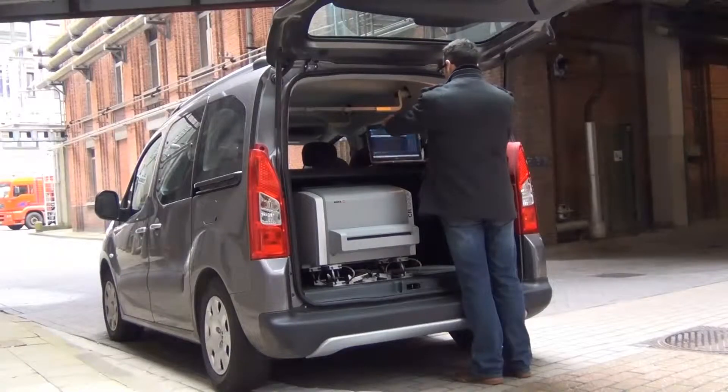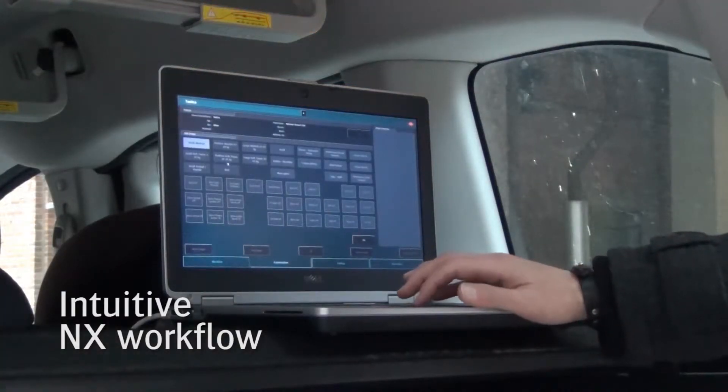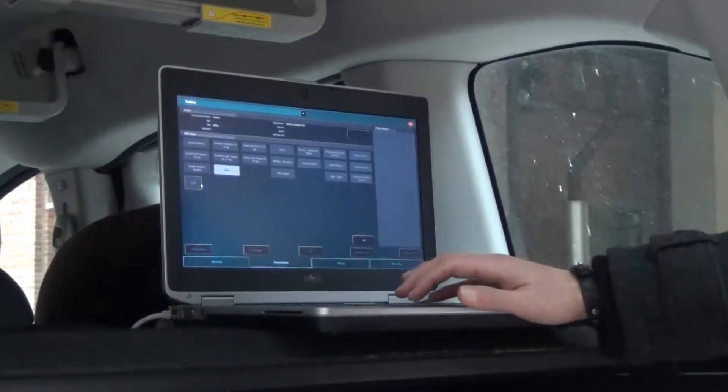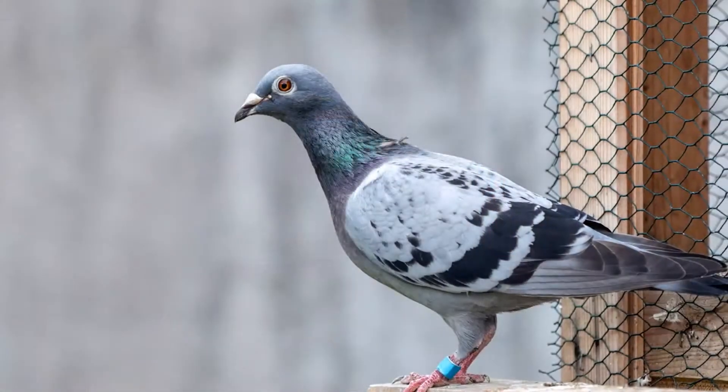In this mobile environment, the NX workstation runs ideally on a laptop. You can already prepare your patient study up front. Just take the lightweight cassette and go to your patient to make the X-ray exposure.